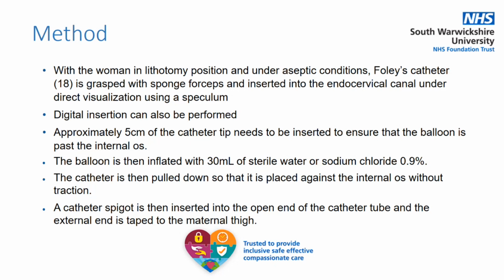Okay, so a short video clip will follow, which hopefully will help when it comes to insertion.